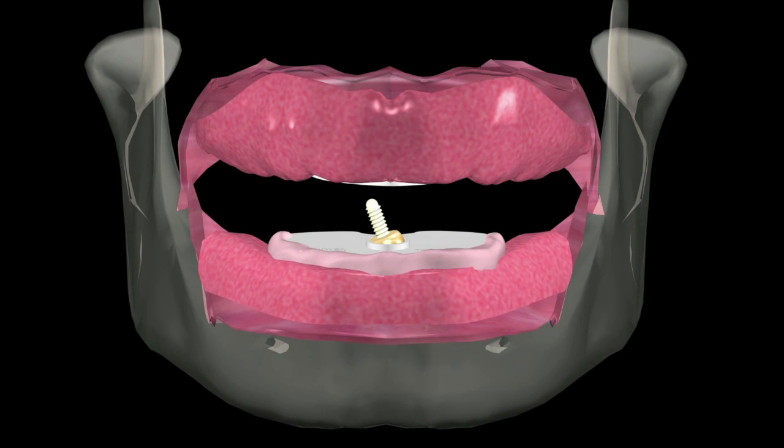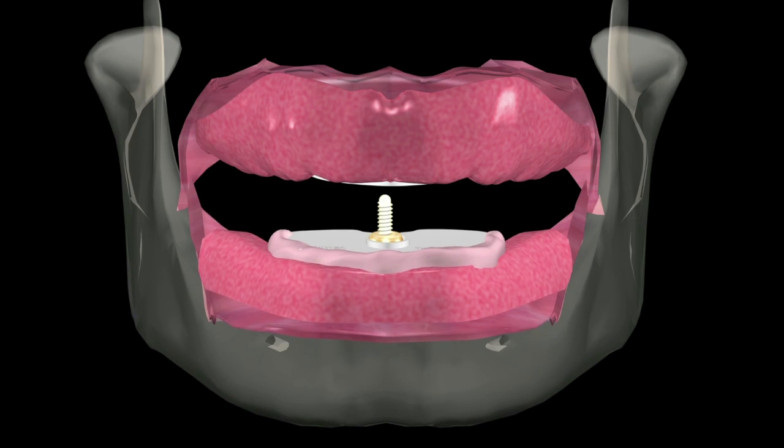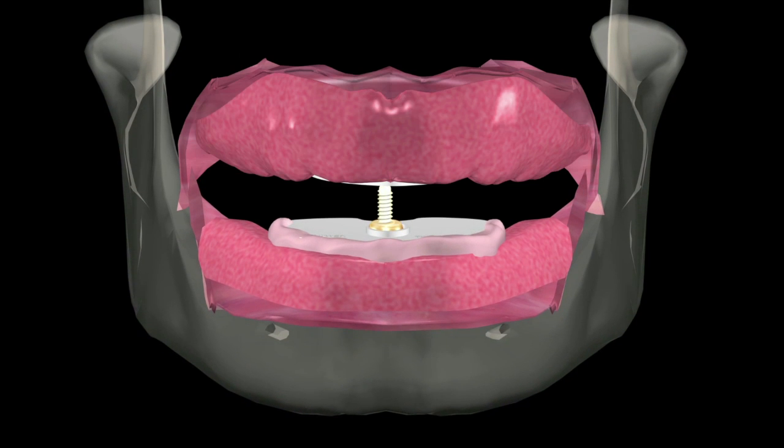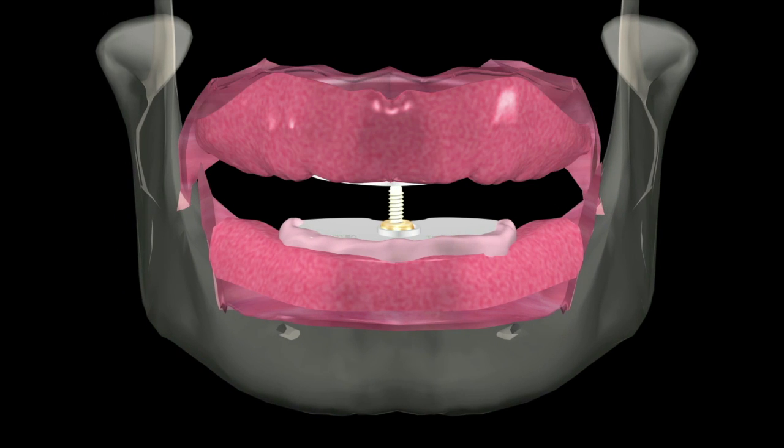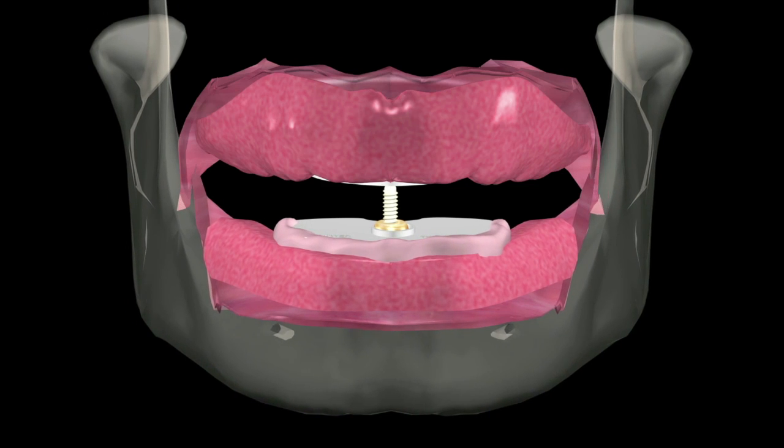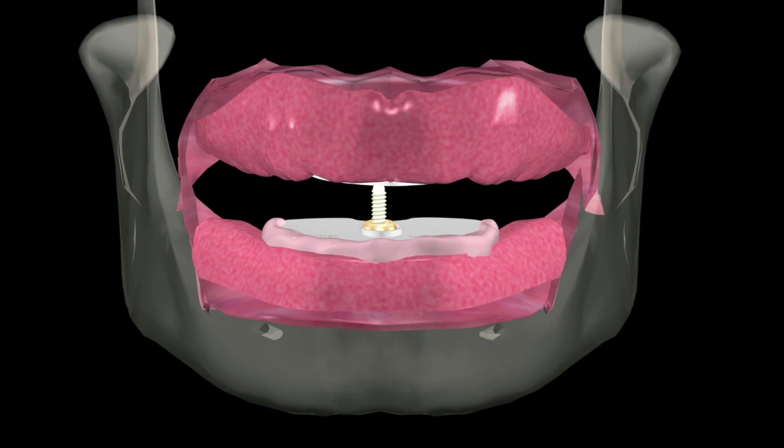The unique design of the Mossad jaw recorder allows the operator to reposition the pivoting nut, establishing the proper perpendicular relationship. The base plates are then seated and the pin contacts smoothly on the striking plate without rotational movement of the bases.